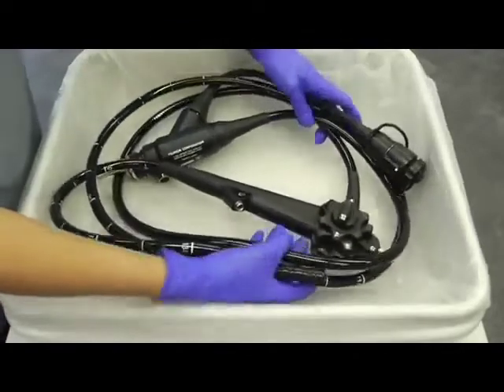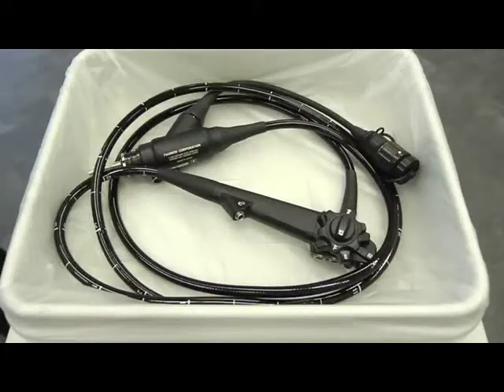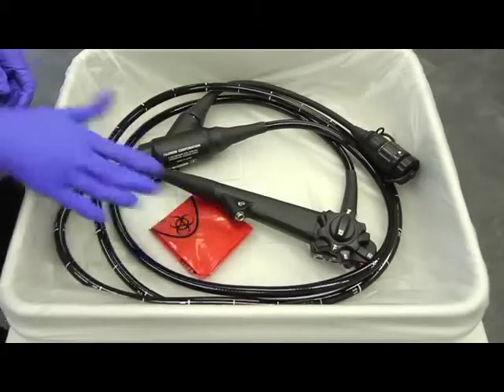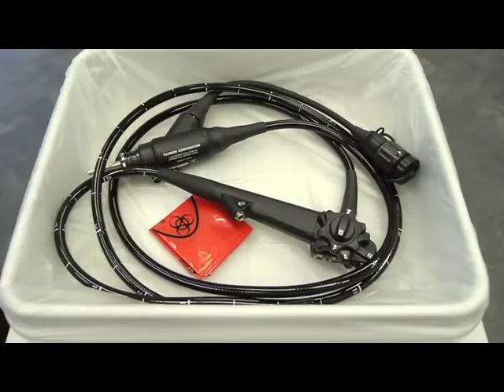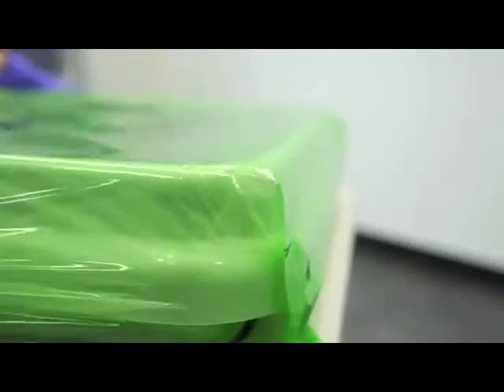Prior to procedure, place the clean, dry, reprocessed endoscope into the lined transport tray along with the red liner still folded. Cover the top of the transport tray with a Cleanerscope green cover, which is clearly marked clean, to indicate that the endoscope has been reprocessed and is clean and ready for use.